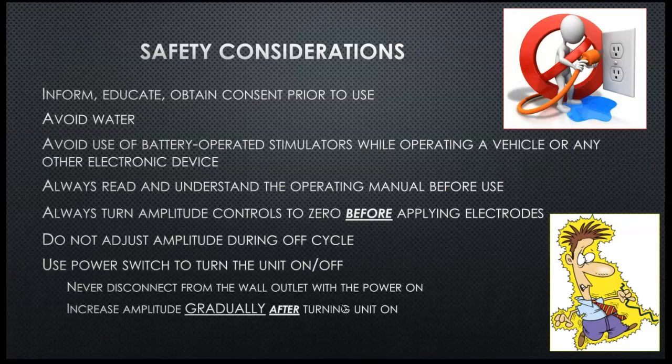Something just to consider, you are working with electrical devices, so be careful with them. Always tell the patient why you want to use it, inform them, educate them on it, and then always obtain consent before you use it. Obviously avoid water with your e-stim machines. Don't be wet while you're handling it. Don't put it near water. If you are using a battery operated device, like a portable one, they always tell you not to have one of those on while you're operating a vehicle, just because you don't want to be surprised and crash your car if something were to malfunction with the device.